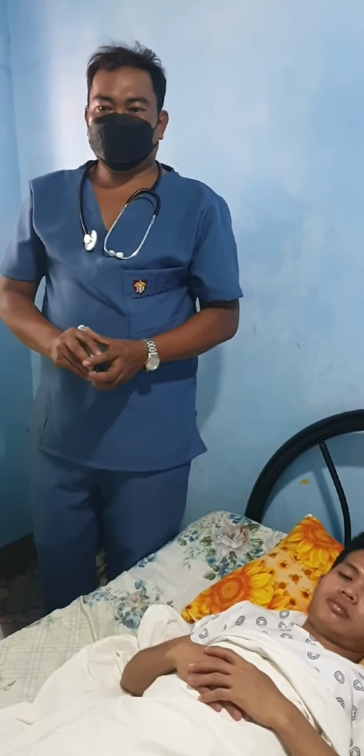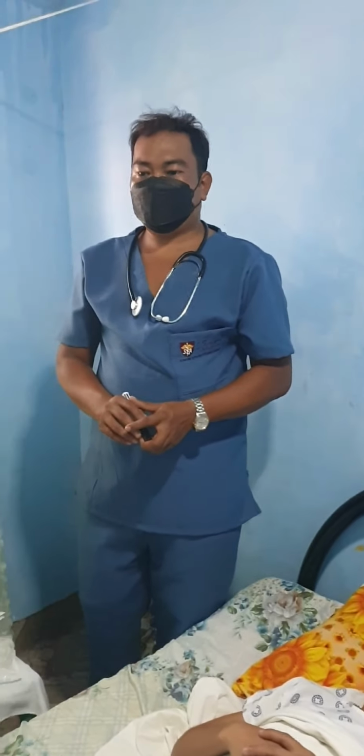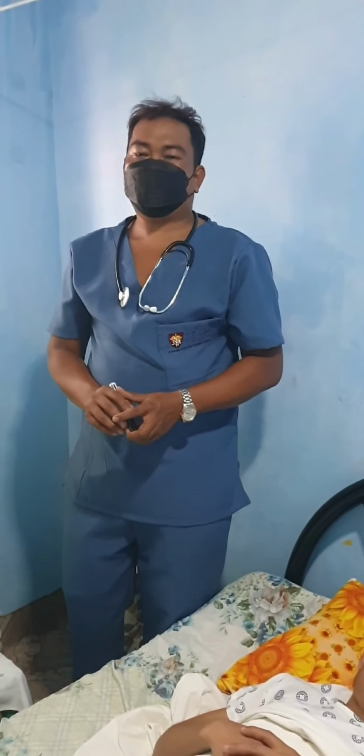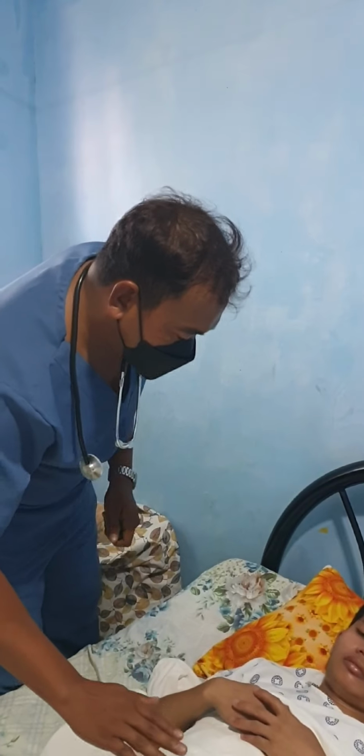Palpate the patient's abdomen for distention or pain and rigidity. Auscultate for the bowel sounds. This is to document the assessment findings and determine the appropriateness of NGT insertion, and relate the reason for the insertion and the patient's physician's assessment. Tell me, sir, if you feel hurt or not.